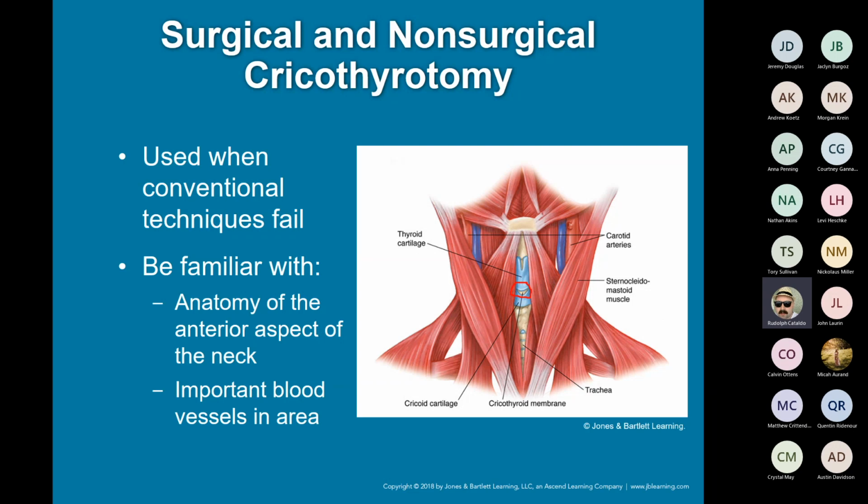Everybody's big concern is, is there a chance I'm going to hit their jugular vein or a carotid artery or whatever it is. I mean, the arteries run pretty far away on either side of the neck. If you're overcutting that far, you're probably going to hit an artery. But right down the center, no matter what tissue it is, if we create an incision, we are going to see bleeding. We're going to see capillary bleeding no matter what. But surgical is using a bladed edge. Non-surgical is like a needle or a quick crike.